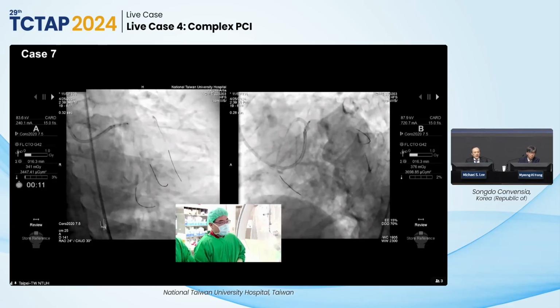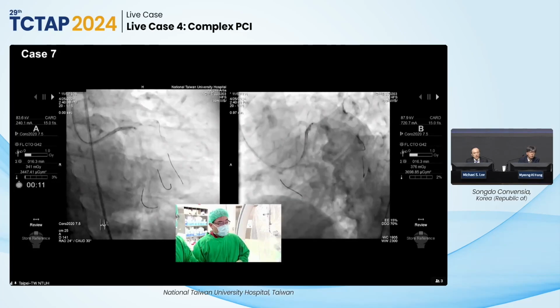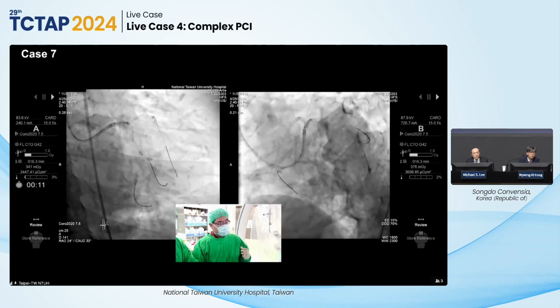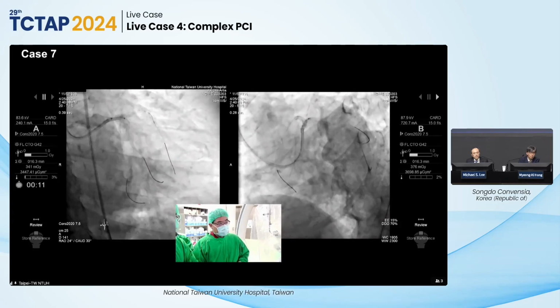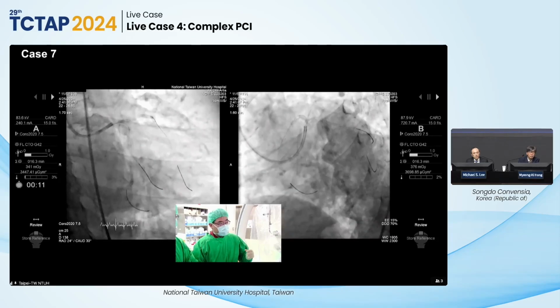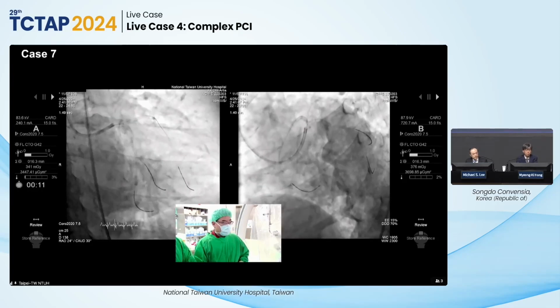What do you think, Wolfram, about the expansion? Yeah, next one. You will see it was delivered very gradually at a relatively low pressure, so we did this very gently. Next one. Next. We make the balloon make the curve gently and then inflate gradually. Okay. And this is the result. Great. This is where we are right now.